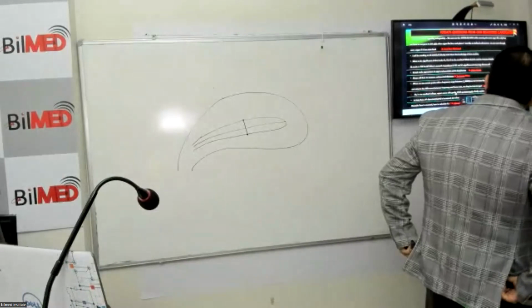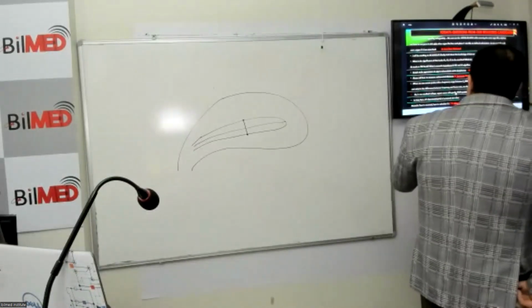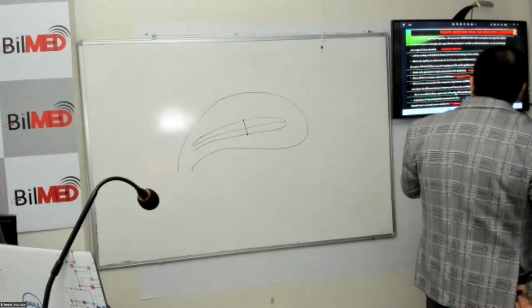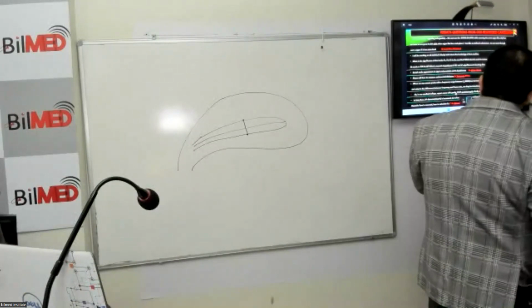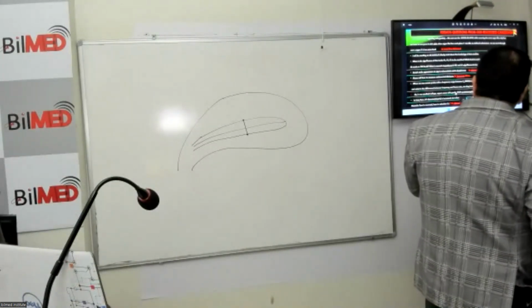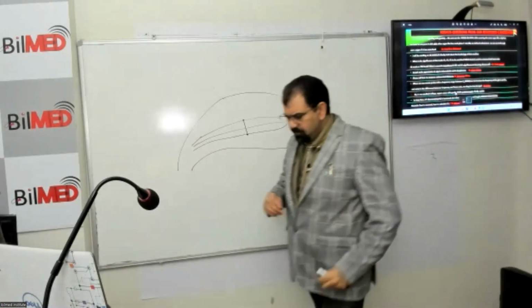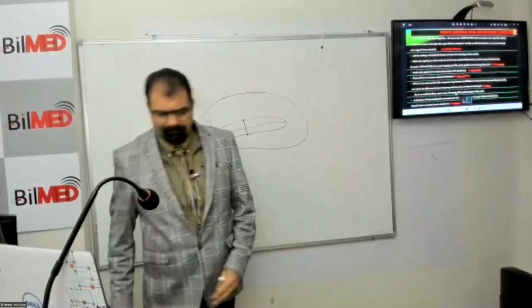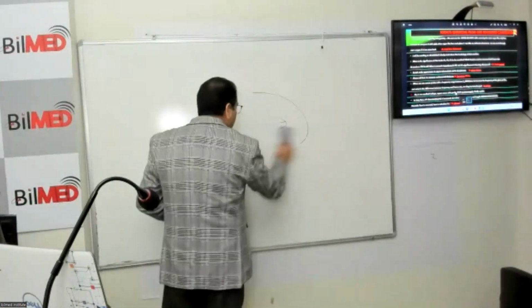Next question from Dr. Judd. How is that when we use convex probe with a frequency range between 2 to 5, how to increase the frequency of the given probe? And what is the difference between the frequency and the frame rate? Can they be interchangeable? So the point here is that, again, I have to come to the probe, knobs or knobology.